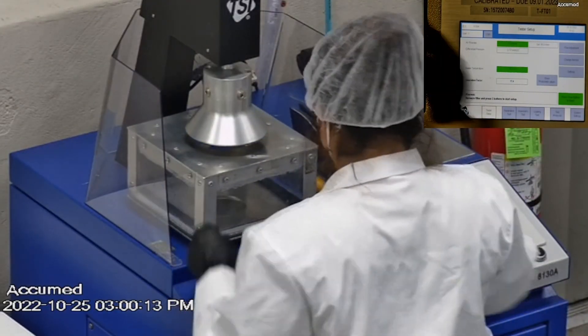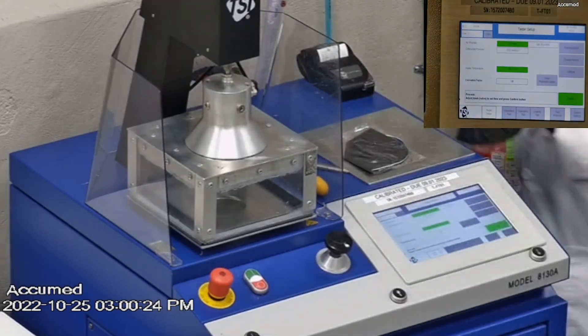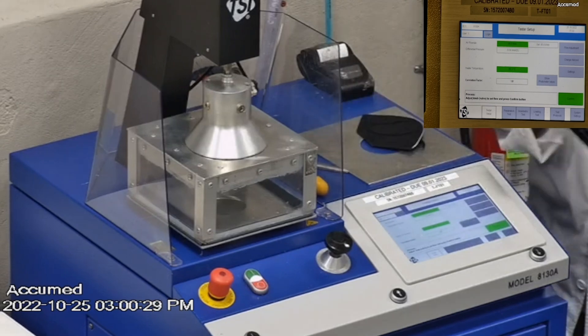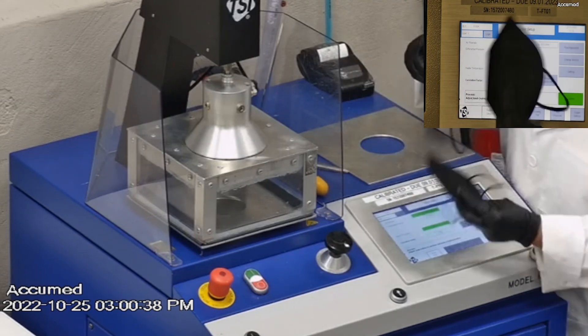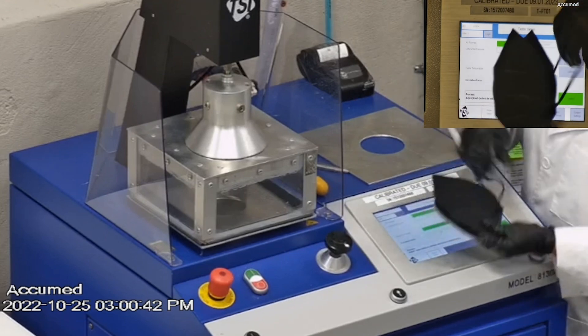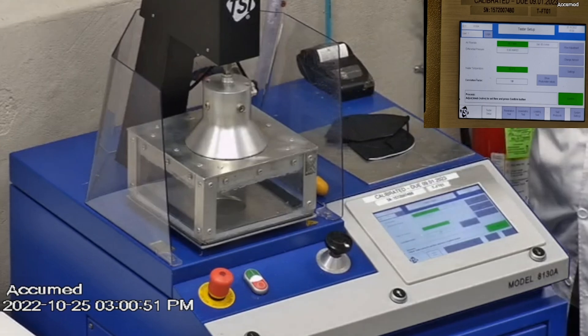This is our TSI machine model 8130A, which is the same filtration testing machine that NIOSH uses to approve N95 respirators. Our procedure is also inspired by NIOSH. We first run a tester setup and remove the headband from the respirator before placing it onto the testing plate to ensure a proper seal.